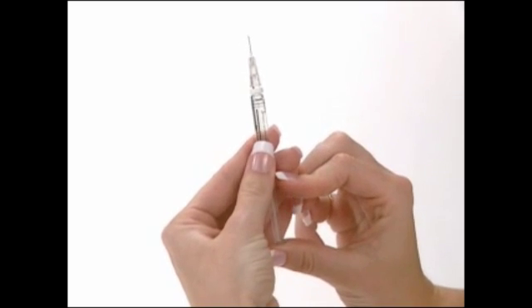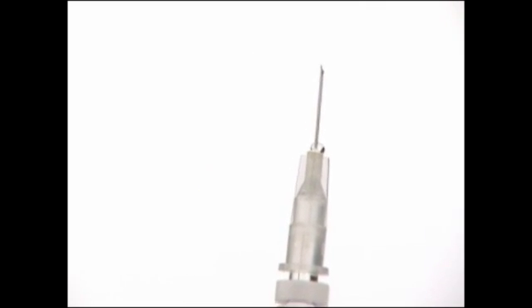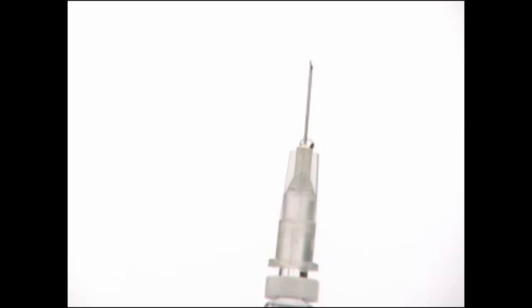With the syringe pointing upward, gently tap on the syringe and slowly push the plunger until all of the air bubbles are gone and a drop or two of liquid appear on the tip of the needle. Carefully recap the needle and lay the syringe on a clean, flat surface. The syringe is now filled with a prescribed dose of Gonal F RFF and is ready for administration.